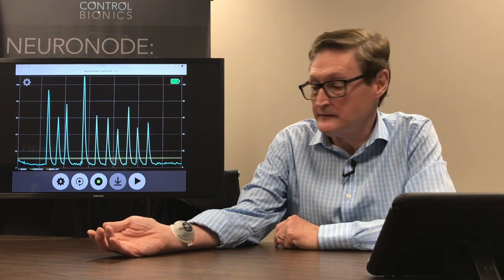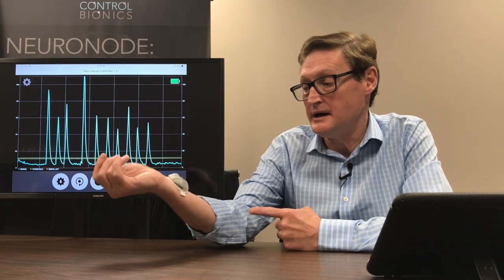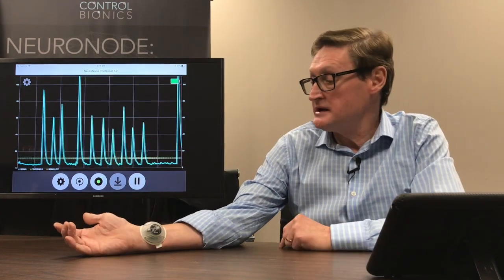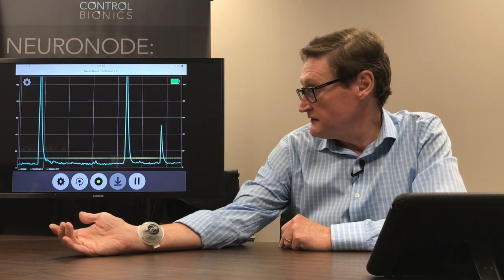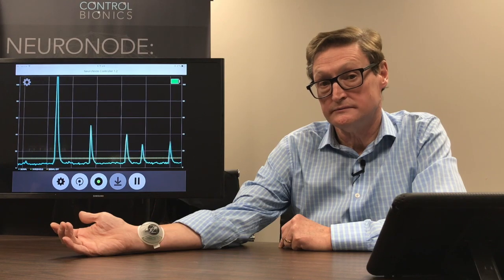So how does it work? Well, it's a simple light device which can go on a number of muscle sites. I happen to have it on over my wrist at this stage. And you can see that if I was to make a small movement, the green light will go on as I make a signal. Very easy. And you can see I really don't have to make much movement to create a signal.